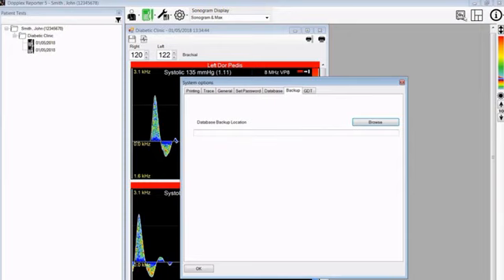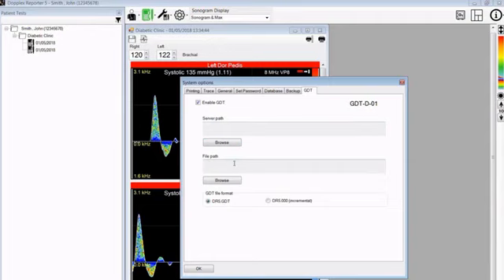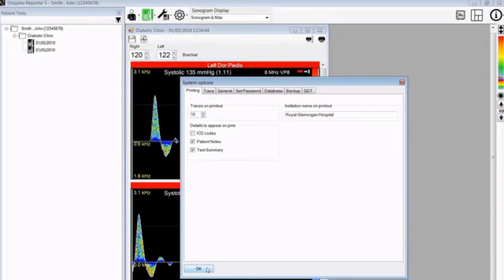Then if you click on the database button, which is the safe icon, it will automatically back up your database to your specified location. There is a GDT interface built into the system which can be enabled by clicking here. The server path and file paths can be set up to work with a full GDT system, which is a file communication system to a patient database. So that has taken you through all the system options available on the DR5 version 5.1 software.